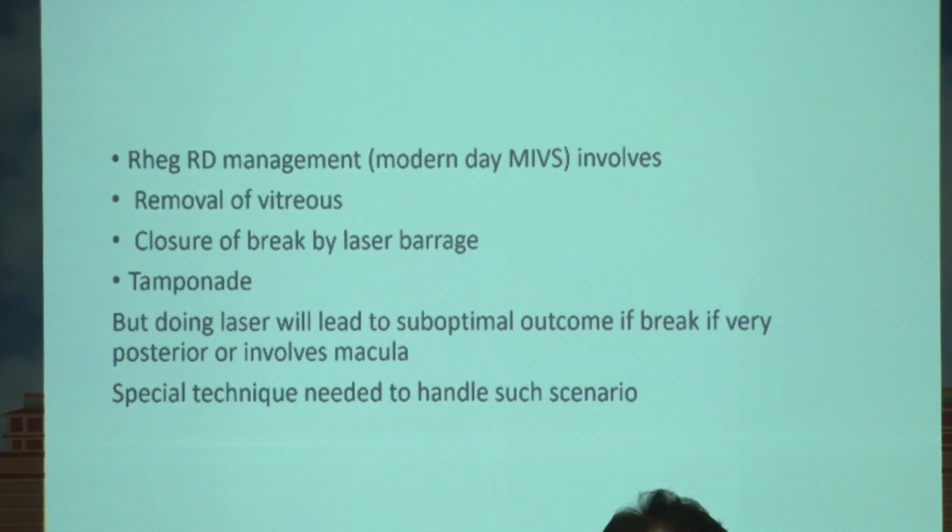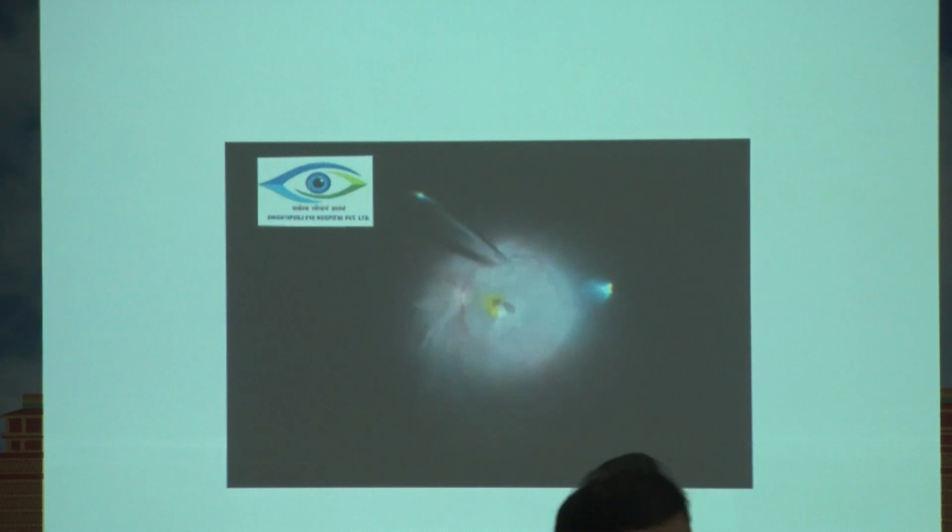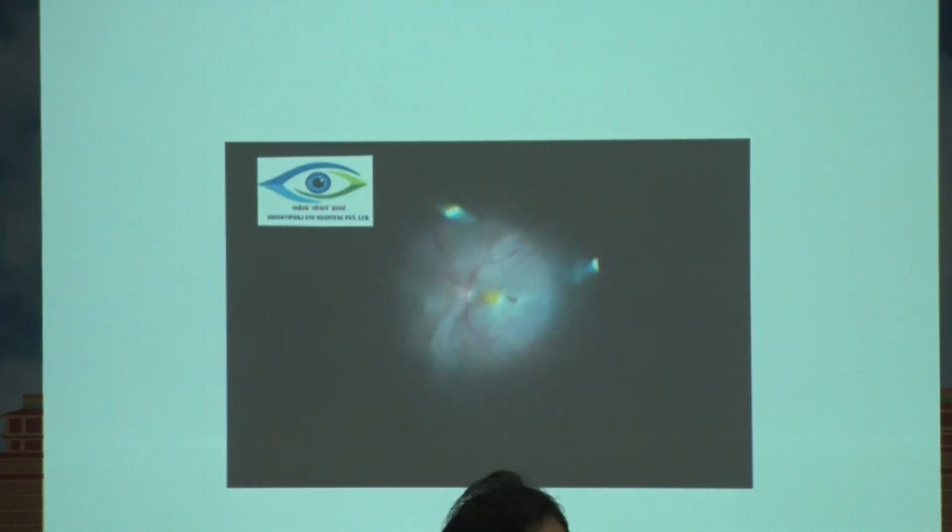But a typical challenge comes whenever we face a break near the macula, or if the break involves the macula. If we go on to do laser barrage or cryo, that will destroy the functional macula, and the outcome will be suboptimal and not that good. So what modification can we do?